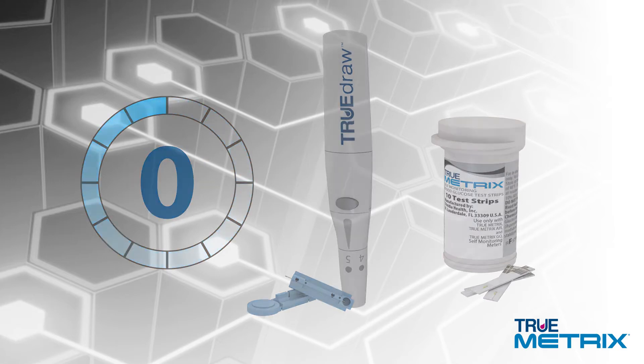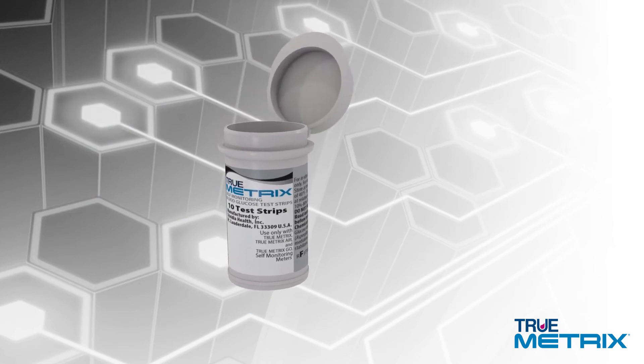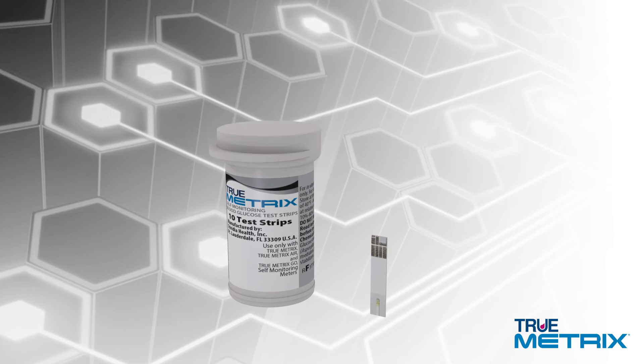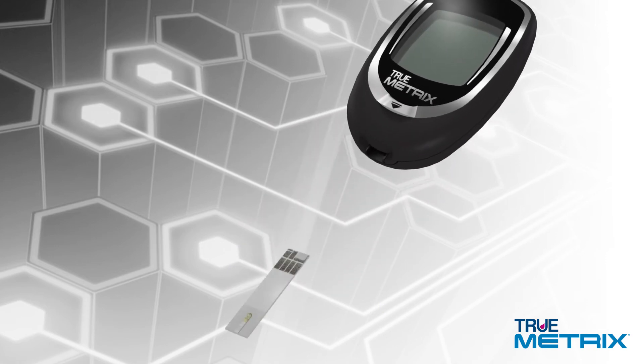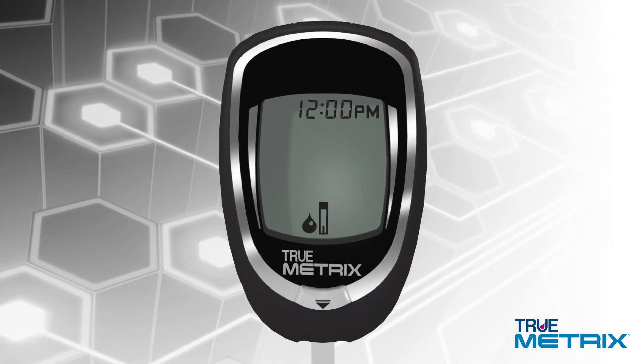Always start by washing and drying your hands. Remove a test strip from the vial and immediately replace the cap. Never leave your test strips outside of the vial for an extended period of time. With the meter off, insert the test strip contact end, contacts facing up, into the test port. The meter will turn on automatically. Make sure the drop symbol appears in the display.